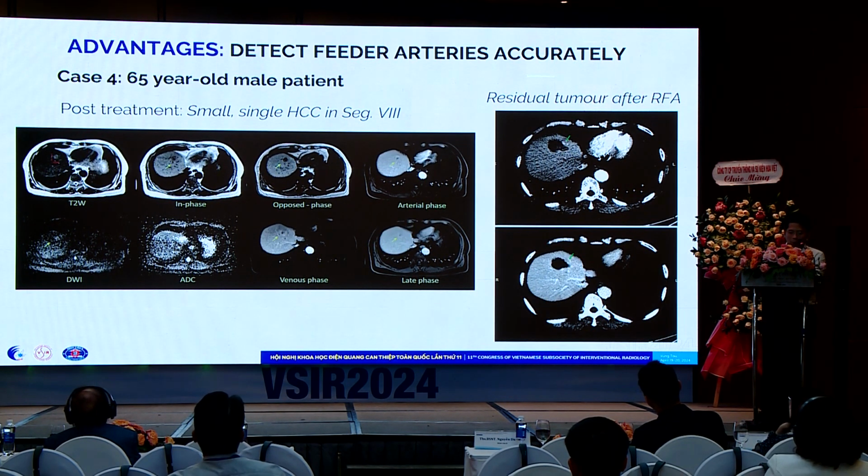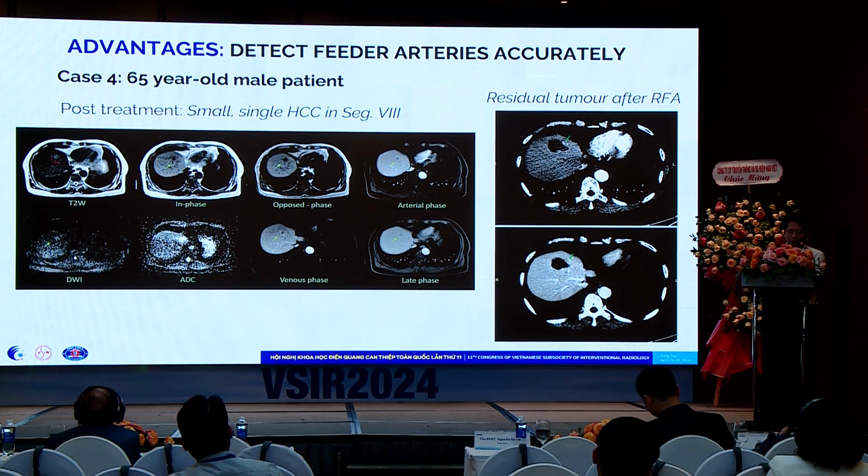So there is a small residual tumor in the CT image that was taken 2 months after the ablation. In this patient, it's hard to ablate this lesion again because we cannot detect the residual portion on the ultrasound. So we chose to perform TACE in this patient.